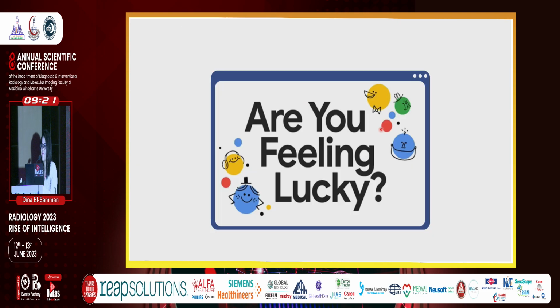And now, my question is, are you feeling lucky? Okay, so let's agree on something. Only lucky neuropathologists get a pilocytic astrocytoma. Yeah, it's a good day when you put the slide and it's a pilocytic with very nice Rosenthal fibers and EGBs.